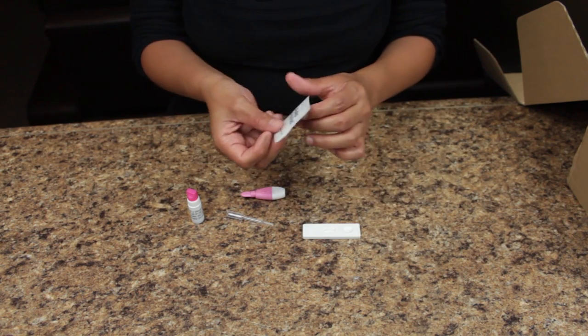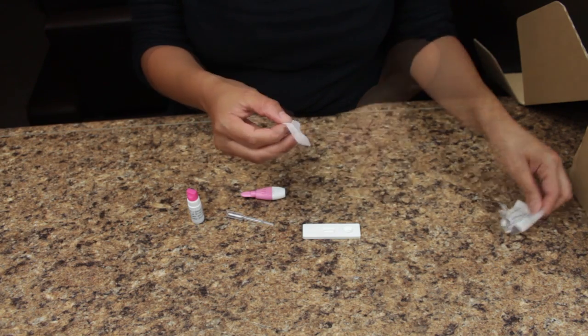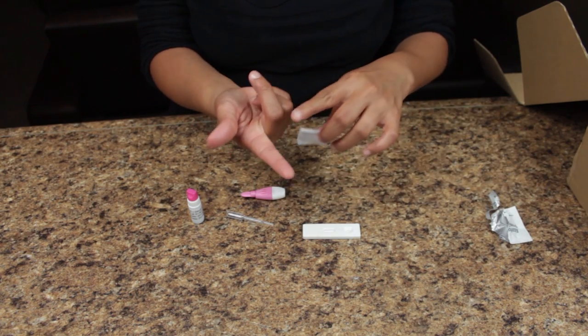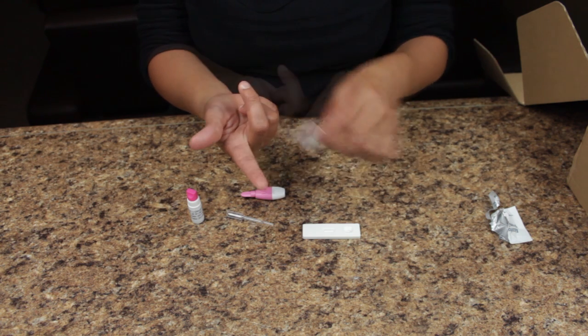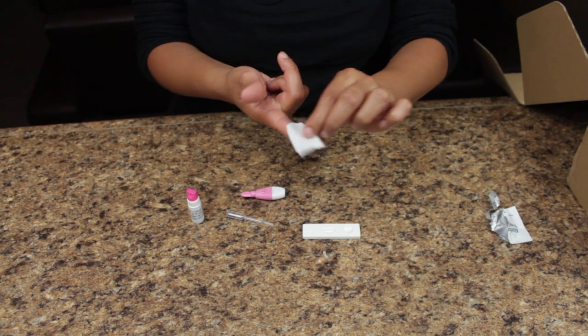Begin by opening the alcohol pad and sterilize the finger to be tested. You will get the best results drawing the blood from the inside surface of the finger. Clean the entire tip of your finger by rubbing thoroughly for 15 seconds.